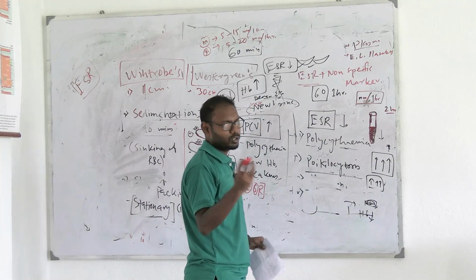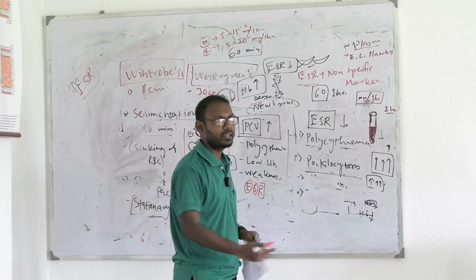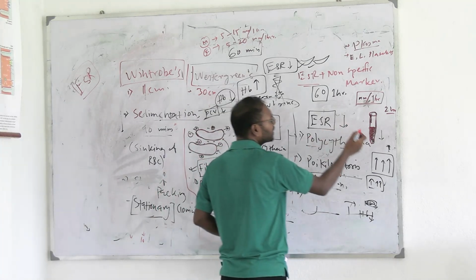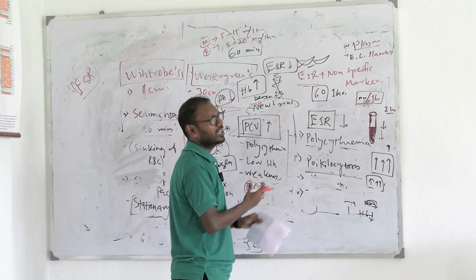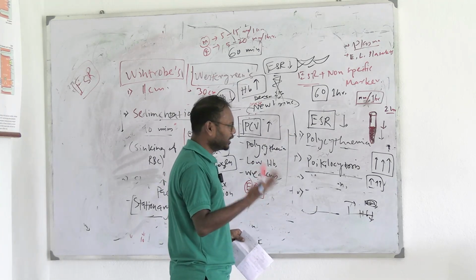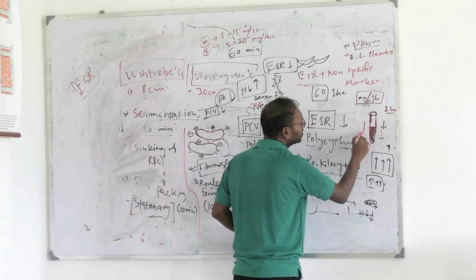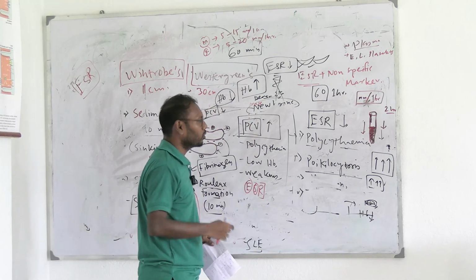Sediment, you have read in geography, sedimentary rocks are actually placed at the bottom of the ocean. Similarly, sedimentation means sinking of these cells. Any cells, any matter, when they sink in a solution, we usually call it sedimenting. So this is sedimentation. What needs to happen? All these cells need to come close together and get down below.